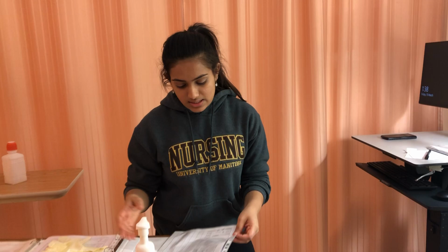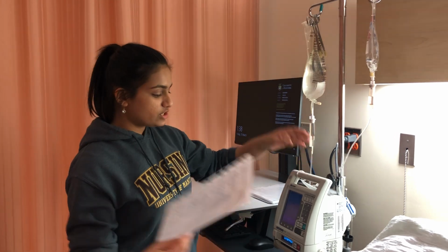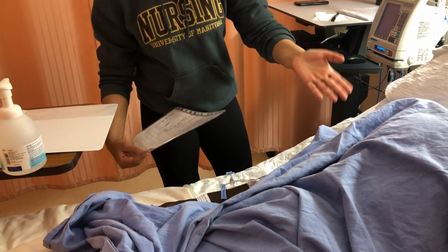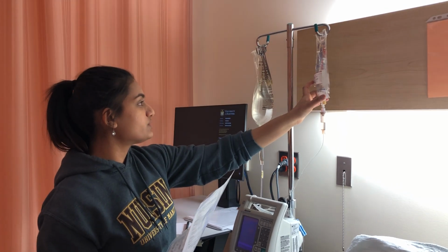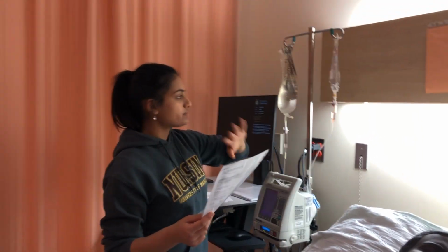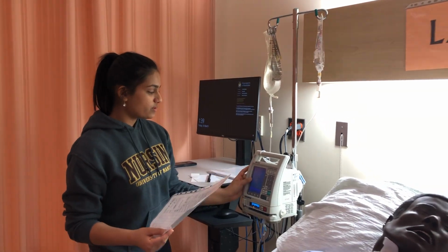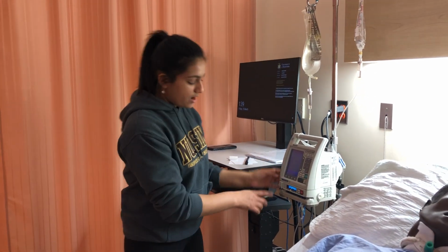So before confirming, I'm going to have another nurse with me check this medication, since this is a high alert medication. So we have our MAR here, and I have the nurse with me, and we're going to go through the medication. She'll go through the MAR, I'll look at the bag. So we're going to compare the patient, Wendy Holmes, VIN number is correct, and the patient has confirmed this. So just looking at the medication, it is the heparin, 1350 units per hour, which will be going at 13.5 ml per hour. It's going to be given IV continuous. It's the right route, and the time to be scheduled is now. And she has also confirmed all my program settings.